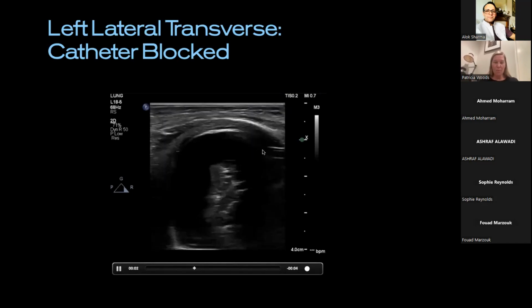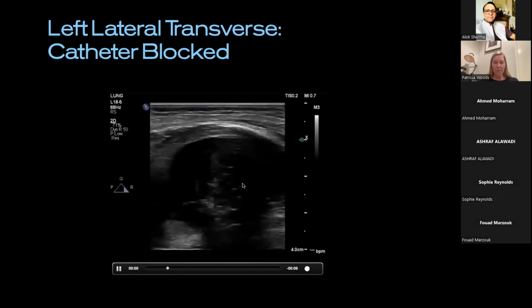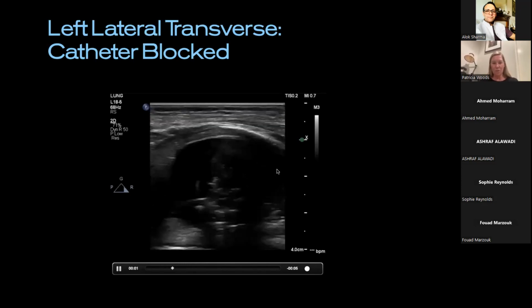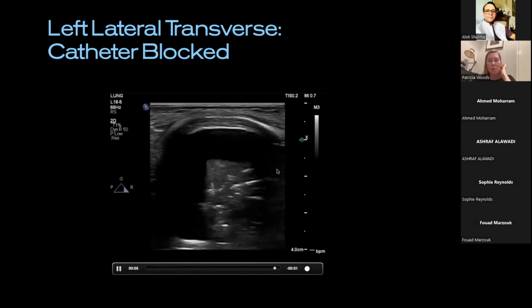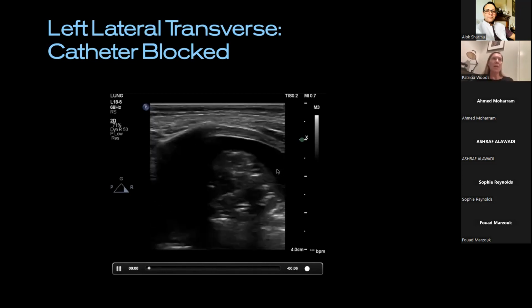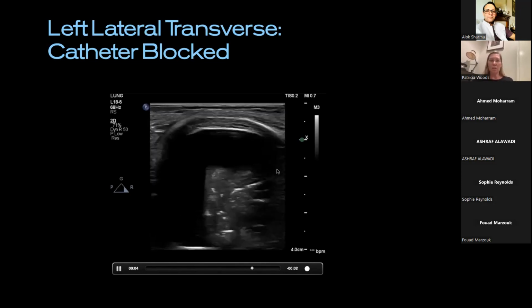What I was getting was a big buildup of this fluid, diaphragm down here, and the non-aerated lung bobbing away up here. So clearly I needed to unblock this tube. And I love this for the serial assessments, so quick, so easy, one or two planes, deepest costophrenic angle, or however your baby's lying. Is it draining beautifully? Are there signs it's blocked? What's the lung looking like underneath?